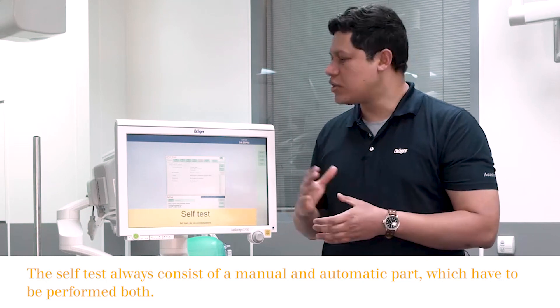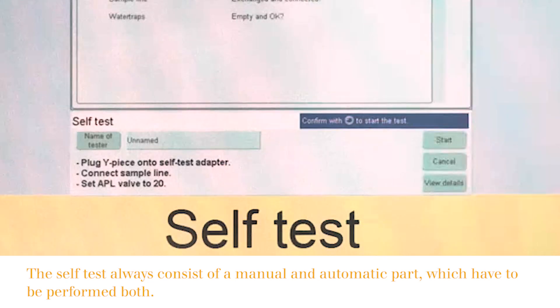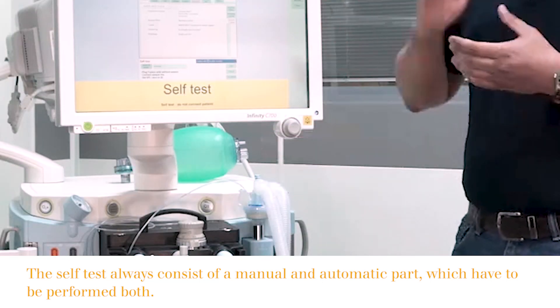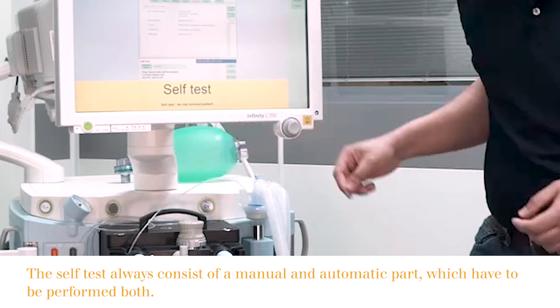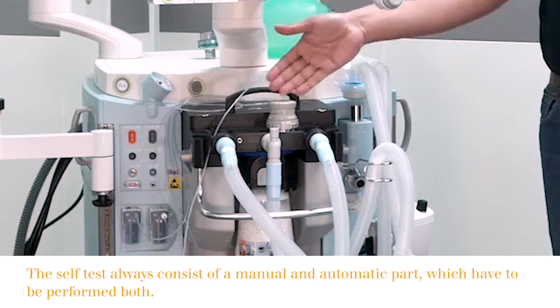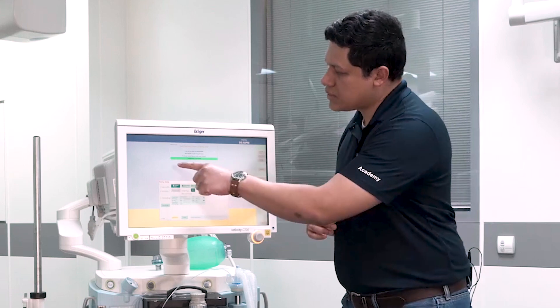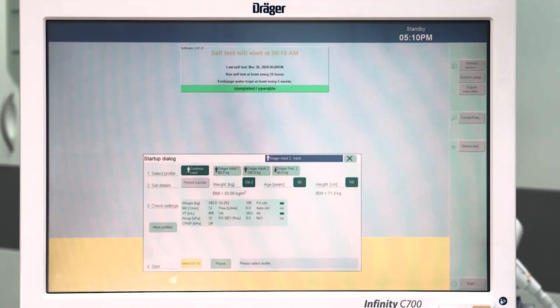After finalizing the verification of all components on the checklist, we can start the self-test after verifying the three final elements. First, we have to make sure that we plug the Y-piece into the self-test adapter. Second, that the sample line is connected. And third, that the APL valve is set to 20. Now we can start and confirm. Once the self-test has finalized, you will immediately see the green flag highlighting that the self-test has been completed and the device is fully operable.